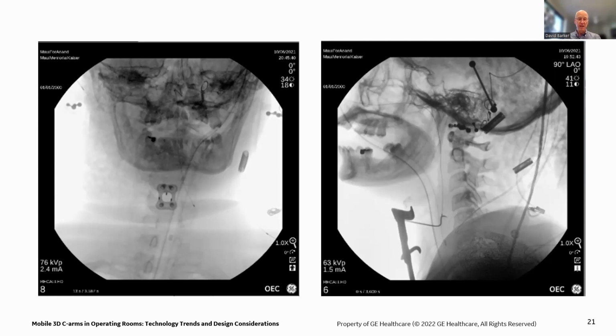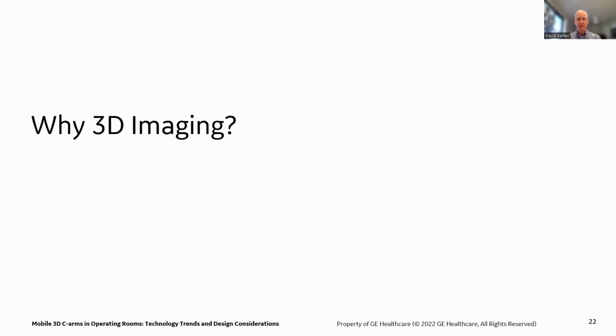Although we're talking about 3D, no doctor is going to walk away from all the simplicity and quick throughput that they can get by these two key shots. They might take more, but they're always going to rely on 2D images for documentation and for their procedures.